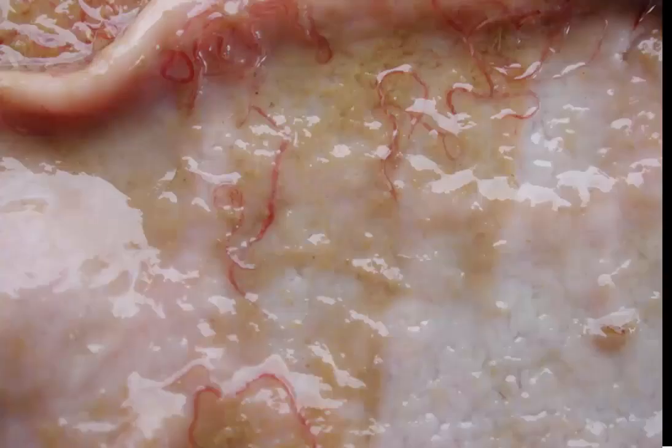Okay, slide number 6 is tissue from a goat. I would like you to give me 2 possible agents in this case. That's it, 2 agents. Okay, time's up. One's just jumping out at you. You couldn't ask for a better representation of Haemonchus contortus.